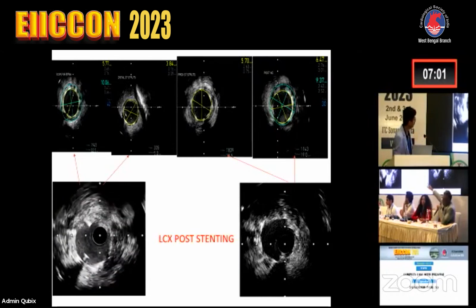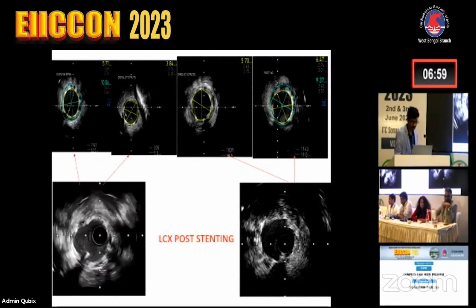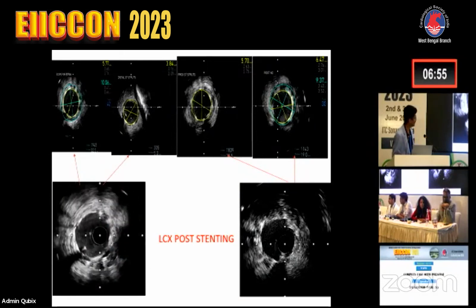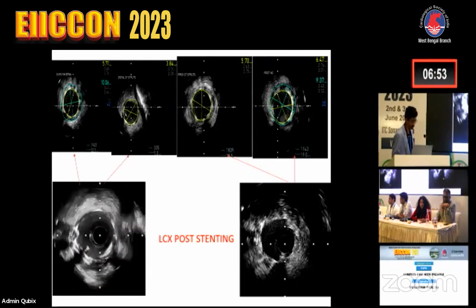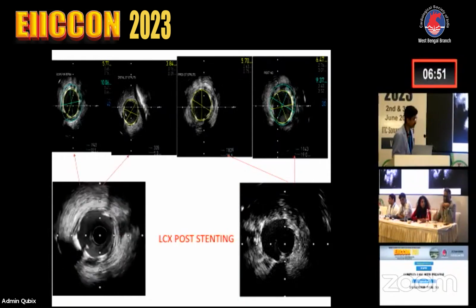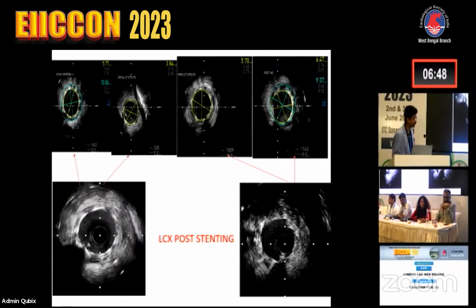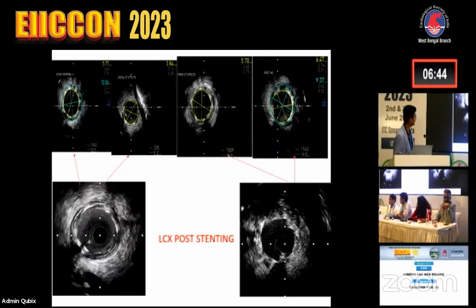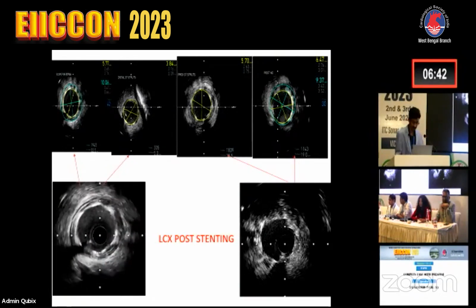There is something moving like a floppy curtain, you know? The black shadow, coming and going. Yes, that might be a moving vein, like a curtain. Right upper corner. This might be a vein. Vein, yes. Okay.